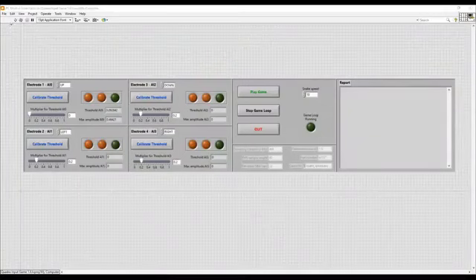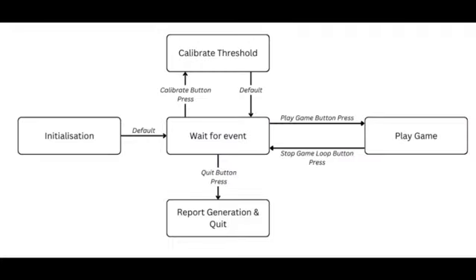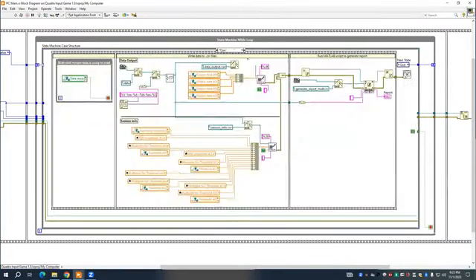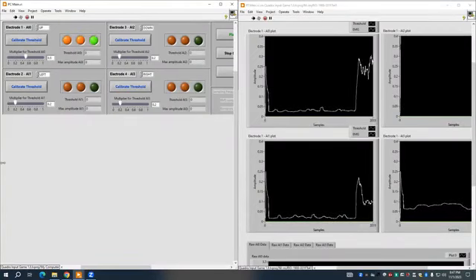The graphical user interface is achieved by the PC-Main that runs on the computer and acts as a link between the myRIO and the game. The user interface is achieved through a state machine. This allows the user to calibrate the threshold for each channel as many times as required without restarting the application. The threshold is set as a fraction of the maximum amplitude during the muscle contraction and can be customized to each individual for optimal rehabilitation and gaming experience.